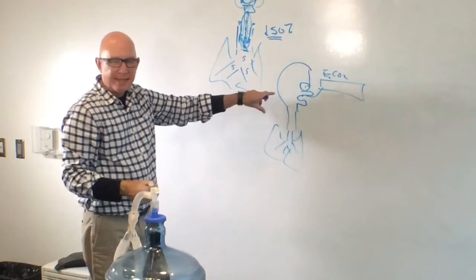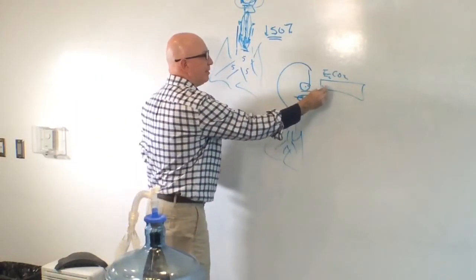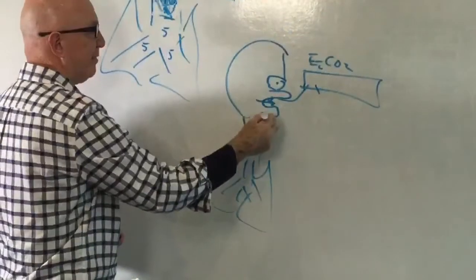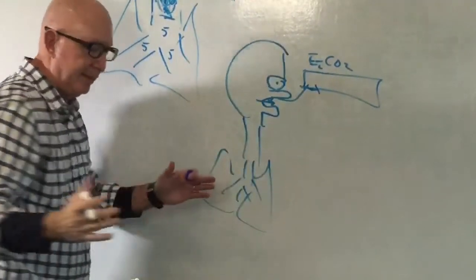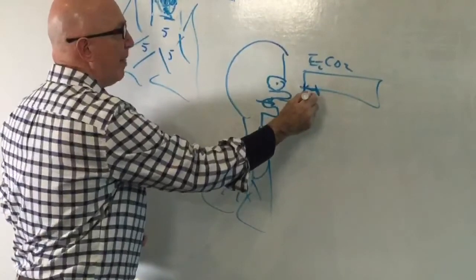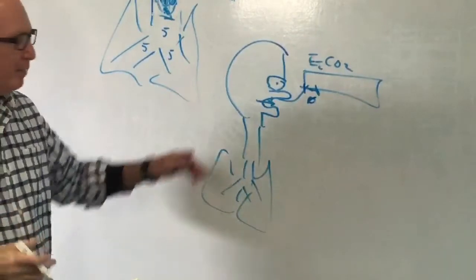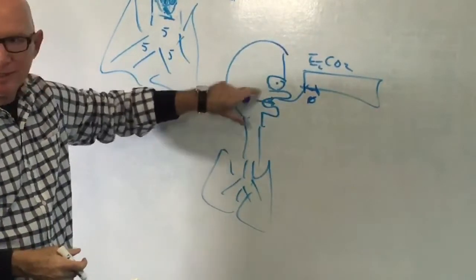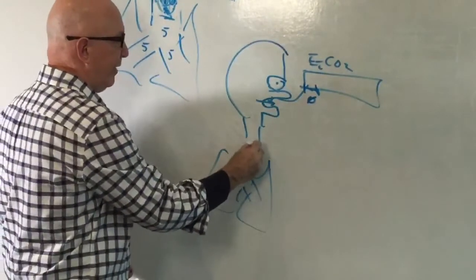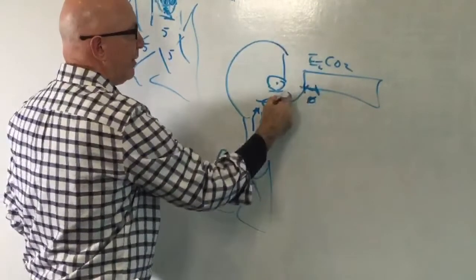When this patient begins exhalation, the first bit of gas sampled is dead space gas, so the dead space of his oral cavity and the dead space of his trachea. If you were to expand the end-tidal CO2 waveform, you would see at the very beginning of expiration 0 carbon dioxide in the exhaled gas, even though the patient's actually exhaling, because there's no gas exchange that took place in these upper airways, so there's no carbon dioxide there. That's essentially ambient gas.